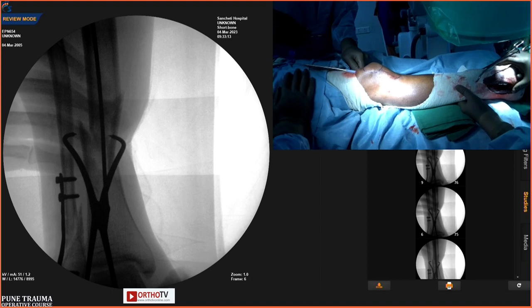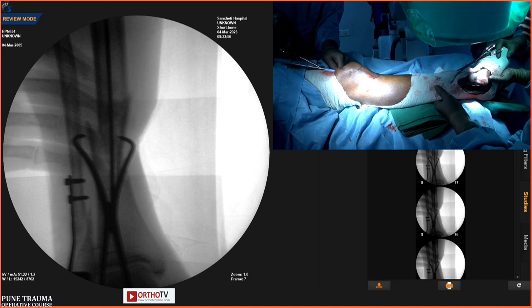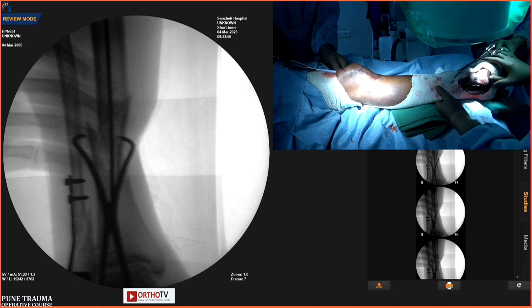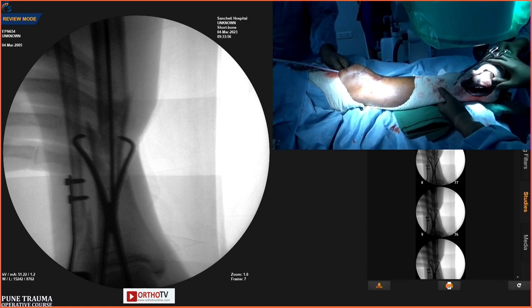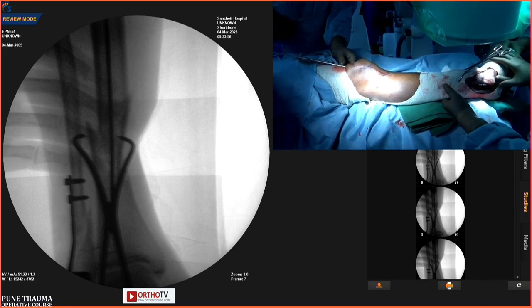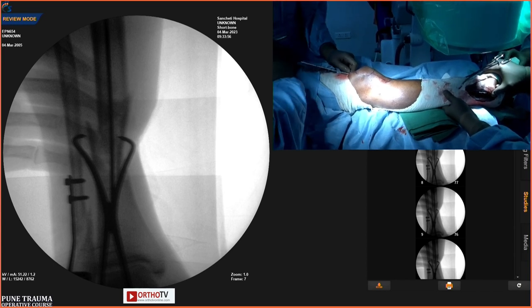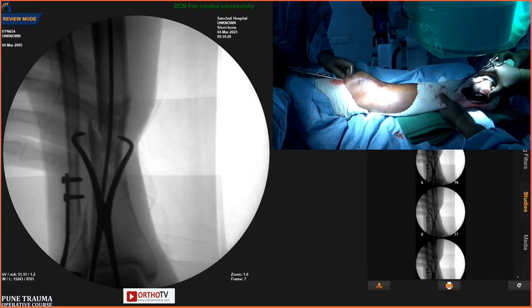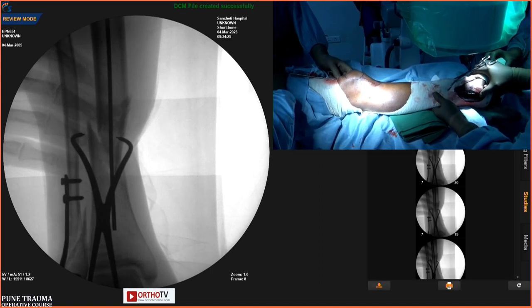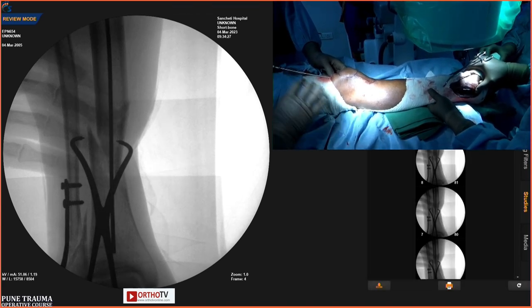No, sir, the fracture has displaced already. Your reamer should be of good quality; it will not displace. If you are fearing that, you can use clamps and additional K-wires transfixing it. Actually, what Sushrut was talking about, all of us will make sure that if we are using a 10 mm nail, we make a tunnel just subchondral, just above the ankle, with a 10 mm reamer. I won't do 11.5 for the distal fragment. I will do that only up to the isthmus. But distally, a passage for the nail to seat will be just above the articular surface.